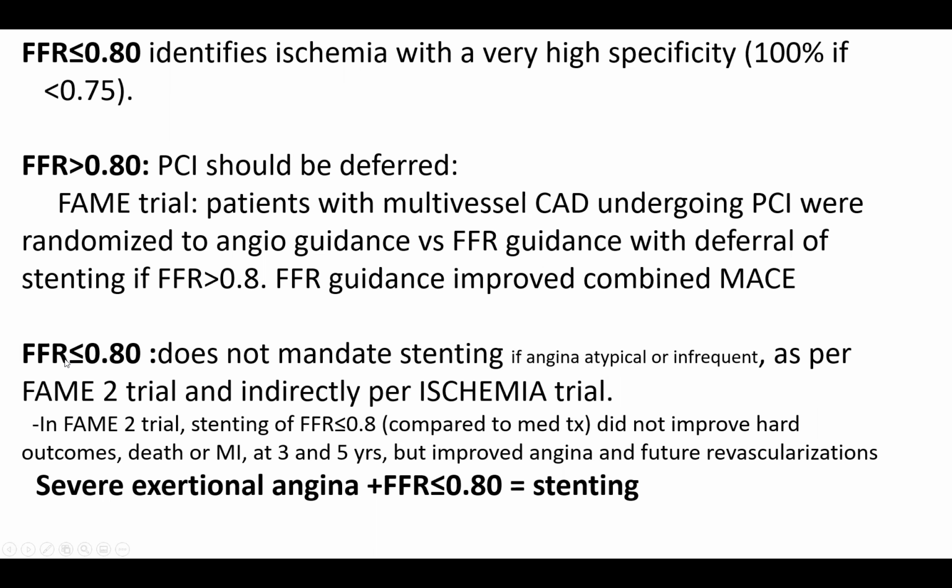Now, importantly, if you have FFR 0.8 or less, that doesn't mean you have to stent. It means you're allowed to stent. In fact, in order to qualify for stenting, you have to have a significant lesion, FFR less than 0.8, and severe exertional angina.